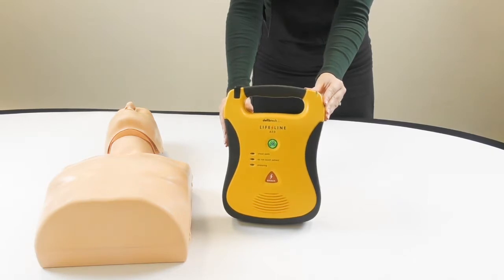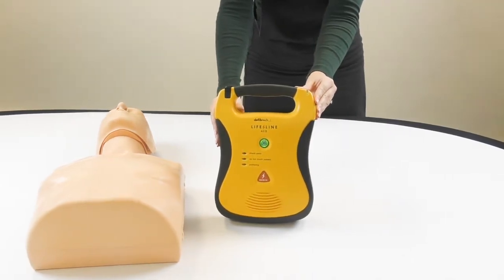Call for help. Remove pads from package in back of unit.